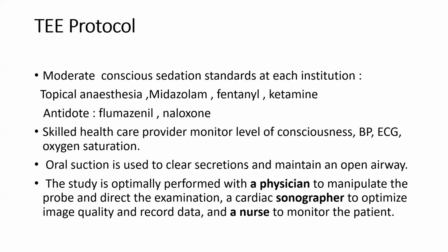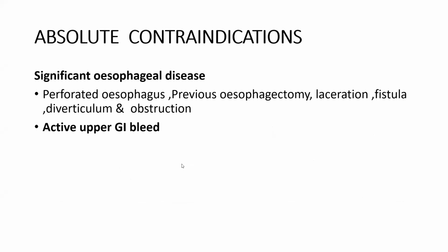And when we were working in the ICU before, the most difficult part for us was the obese patient. Here, no. Here, the obese patient is very good because he has a short neck. The probe, when you put it in, will go directly to the esophagus.